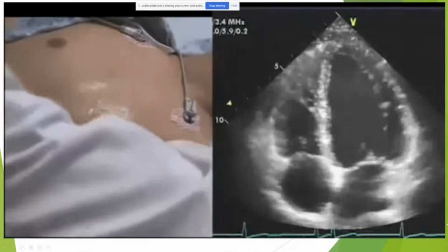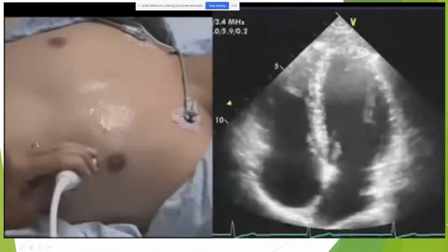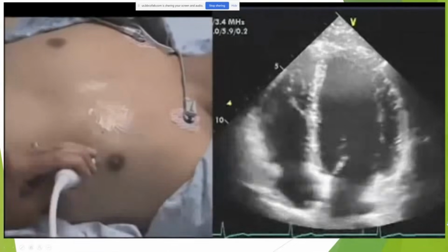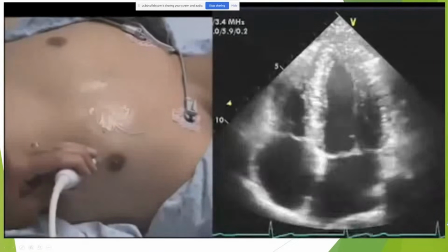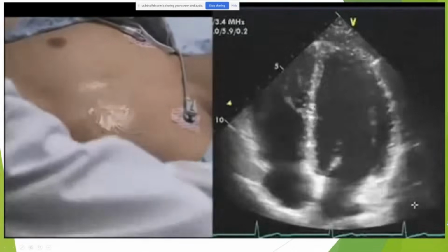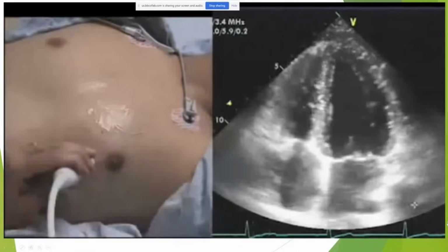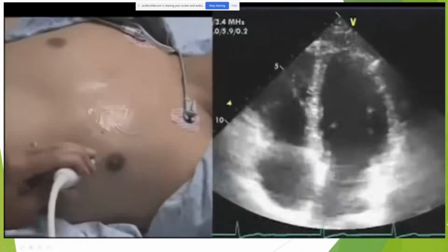If I had a bright right ventricle in my parasternal views, and now I have that left in my apicals, I want to get rid of that over brightness. I want to have good image composition throughout this field of view. So I'm going to back down my TGCs up there, and now I have a nice image again throughout. Sometimes the posterior is bright in the parasternal, and again, we don't want to have this in our image. We want nice image composition throughout the entire field of view.